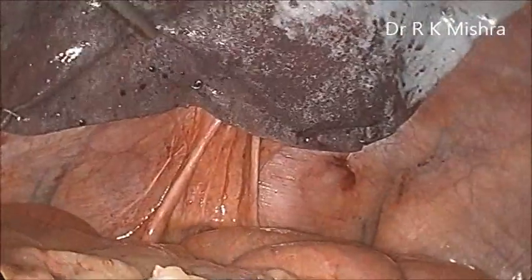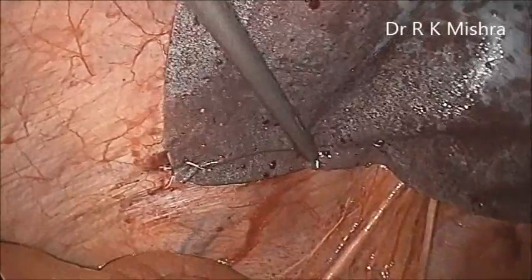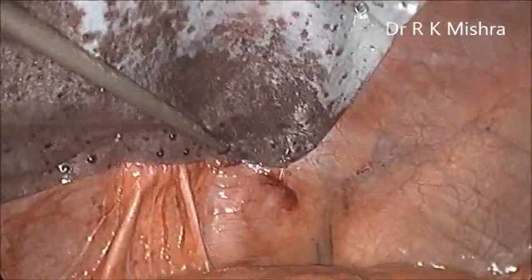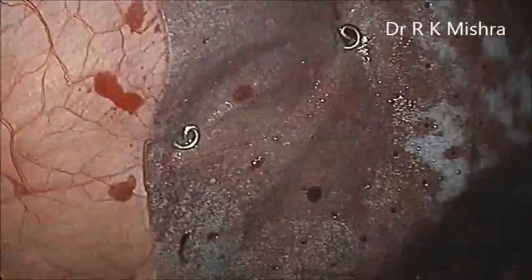A special precaution has to be taken during firing the tackers or stapler — you have to take care that it should be opposed from above, so that you can easily see and perform the surgery without any complication.